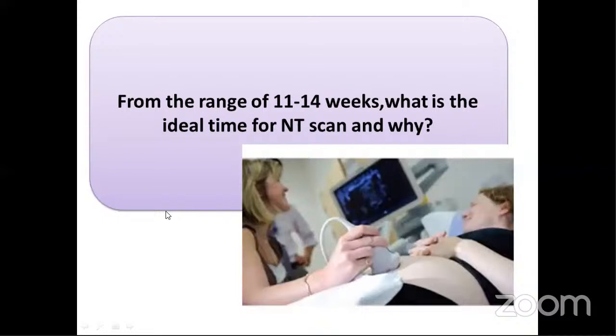Pratima ma'am, can I ask you a question, ma'am? Sure. Ma'am, at a CRL of 45 millimeters, if everything else is fine and the nasal bone is absolutely not ossified, would you prefer calling her back in a week's time or 10 days rather than reporting it as unossified and kind of making her intermediate or sometimes high risk, those kind of situations?